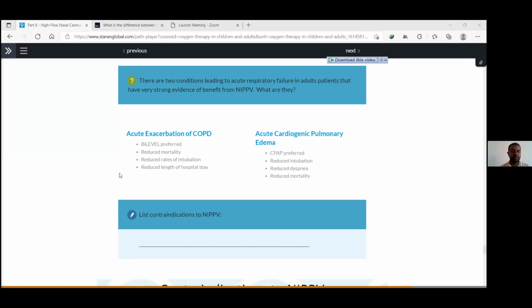Patients that cannot protect the airway, altered mentation, hemodynamic instability, excessive secretions. These are very excellent. Hemodynamic instability, facial lesion, a different answer, but a good choice. And patient at high risk of aspiration, comatose patient, patient with respiratory arrest, uncooperative, inability to protect the airway, burn involving the face, esophageal or gastric surgery, apnea, reduced consciousness.